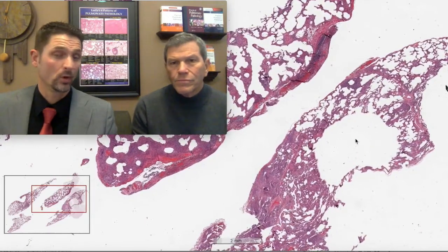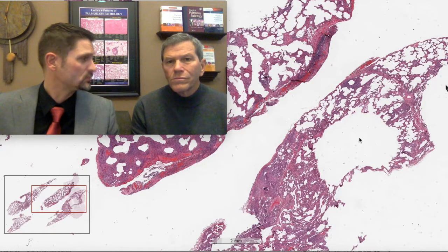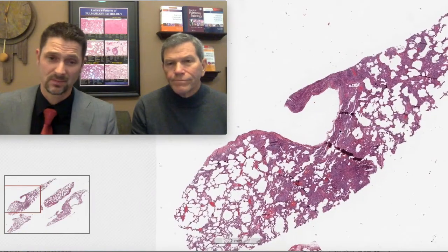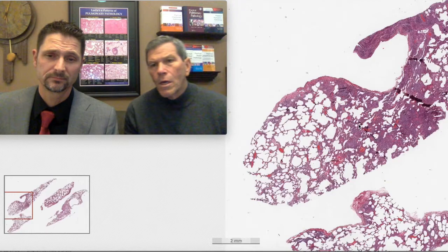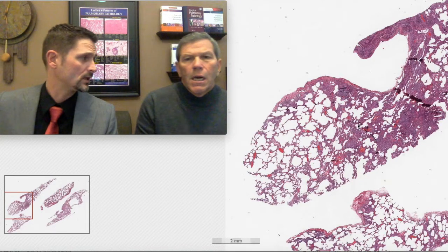We're going to have a whole session on the blue biopsy, right? Yeah. And maybe we should have put this one in the blue biopsy session, because this is a blue biopsy, like big time. So we're thinking inflammatory cells. So maybe we should go look at higher power.